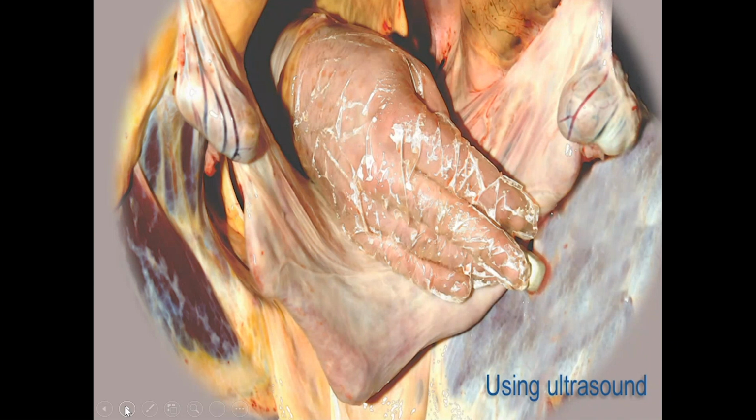Now, as I insert the transducer, I'll probably come across the left uterine horn. I'll aim for identifying that. Then I'll rotate the transducer until I come to the left ovary, have a thorough examination of the left ovary, go down the left uterine horn, join up with the uterine body, keep rotating to move up the right uterine horn, and then come on to the right ovary. And then I'll repeat that examination twice, and then I'll check the uterine body very carefully on the way out.